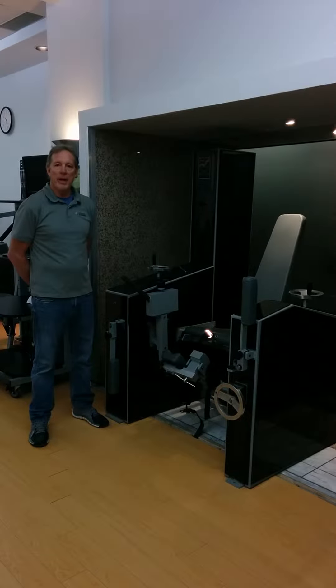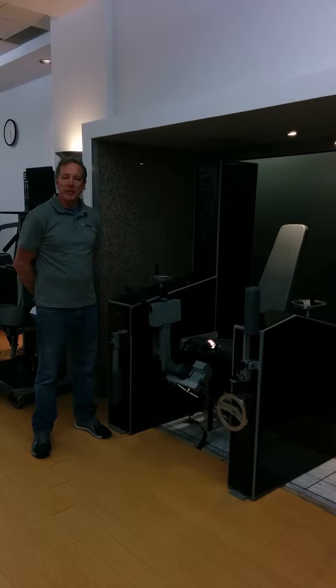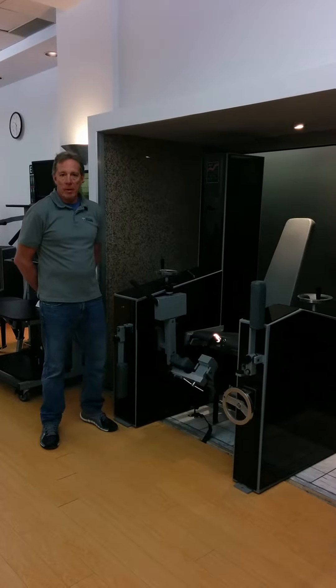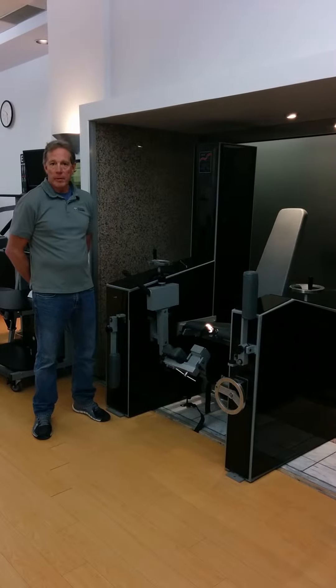Hi, my name is Brian Holmes. I'm here from the Med-X Corporation at New Element Training. I'm very excited to be here to talk about the knee extension flexion testing device. This machine was designed for athletes in mind to test, to strengthen, and to analyze the function of their lower extremity.